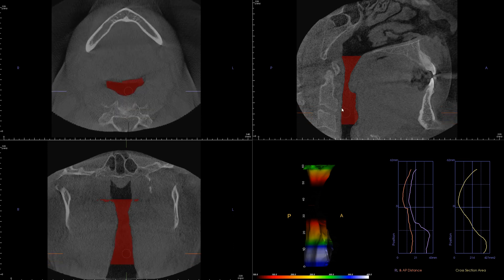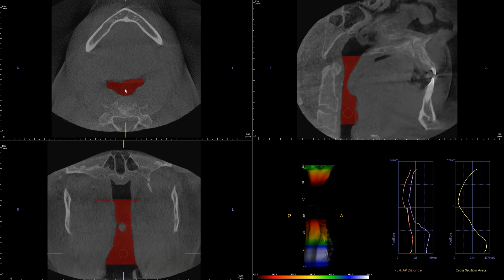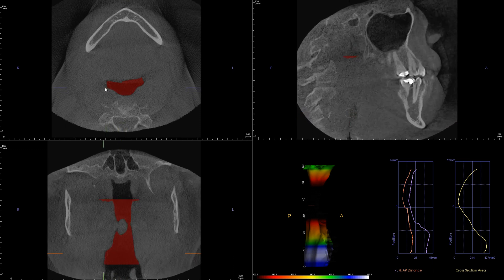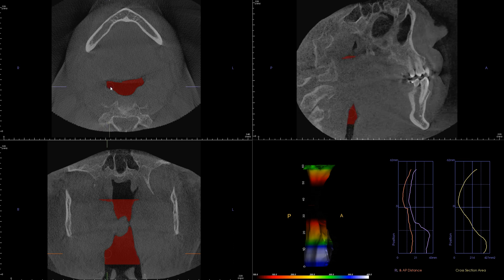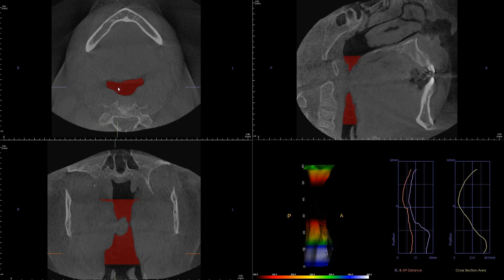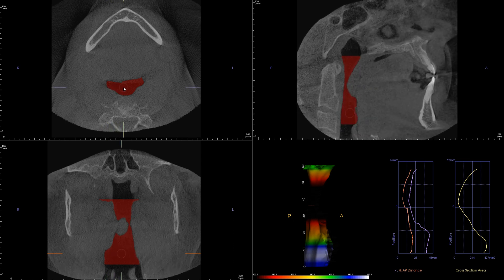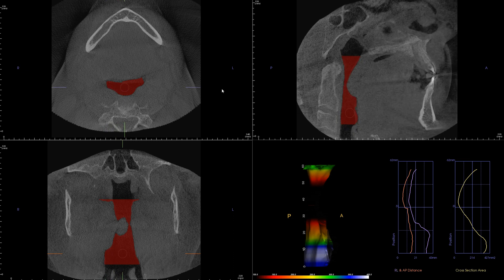Now let's look at the same airway in the sagittal view. Let me start from the patient's right side and as I scroll through you're starting to see the airway highlighted with this red color. As you saw previously, it's wide toward the hard palate, becomes very constricted, and then suddenly becomes wide again.